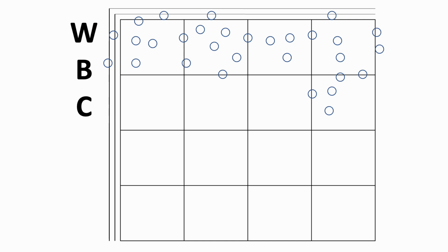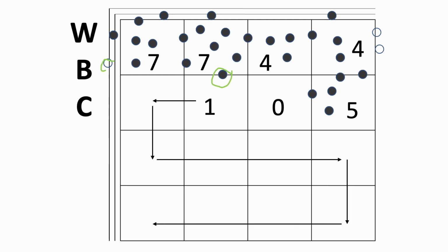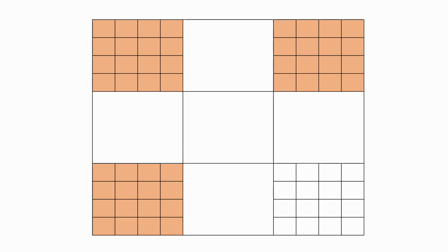Okay. So, for the WBC, it's still the same thing, same manner. Look at this one. This was not counted. This one was also not counted because it's on the third line. Now this one, 1, 2, 3, 4, 5. So, how many is that? 5 in all. So remember, these are the 4 areas where you need to count for the WBC.